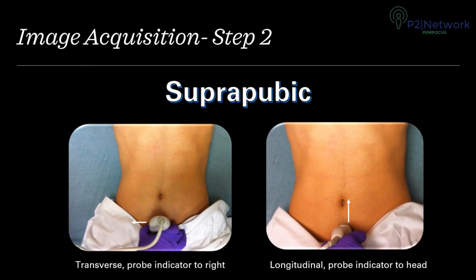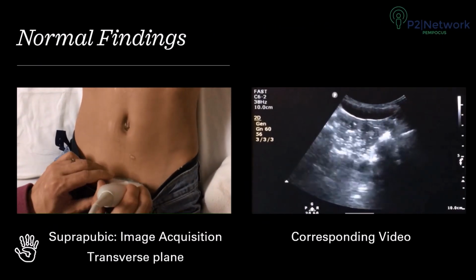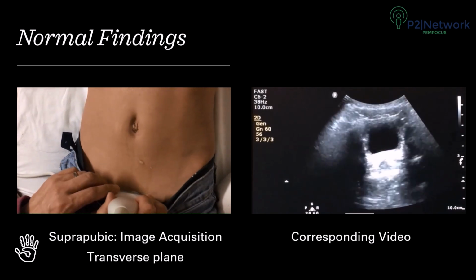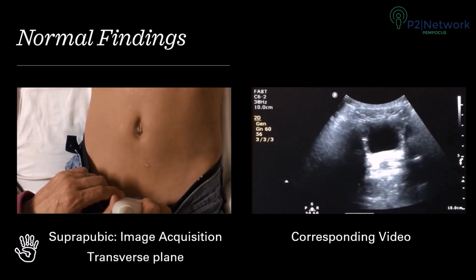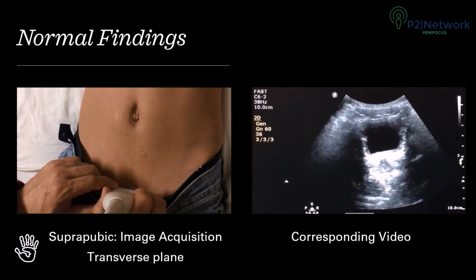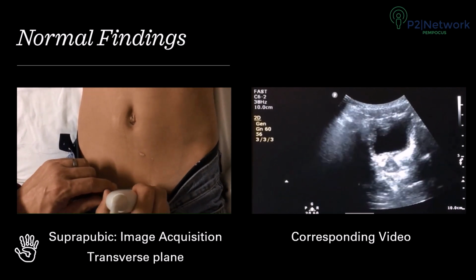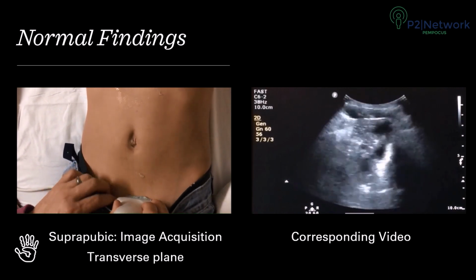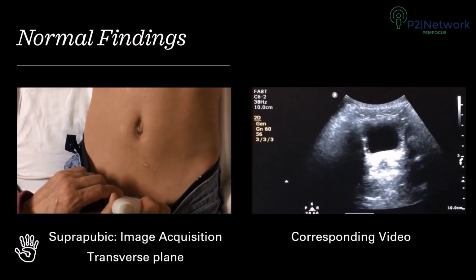The pelvic or suprapubic view attained during the FAST exam consists of looking through the bladder in both a transverse and sagittal fashion. In the transverse view, the bladder should look like a square or a piece of toast, and you can see the hand placement on the left side of the screen with the image that is acquired when fanning through the bladder on the right side of the screen. This is a normal image.